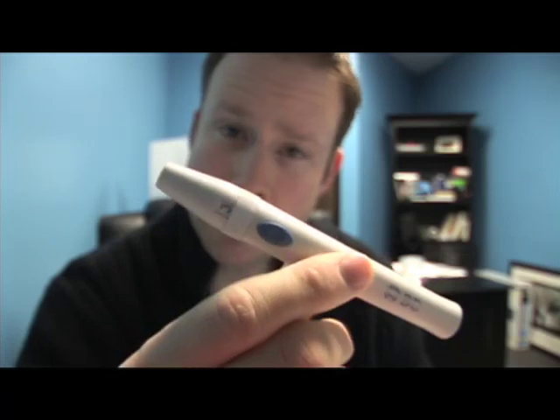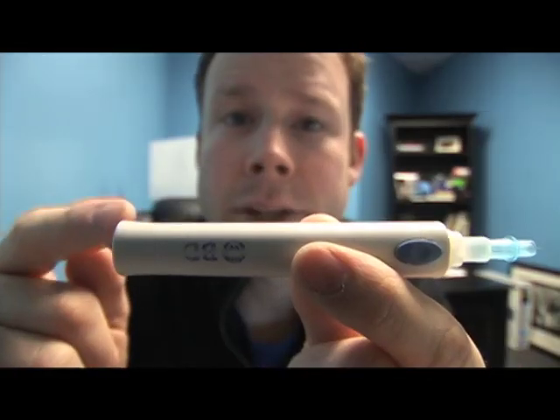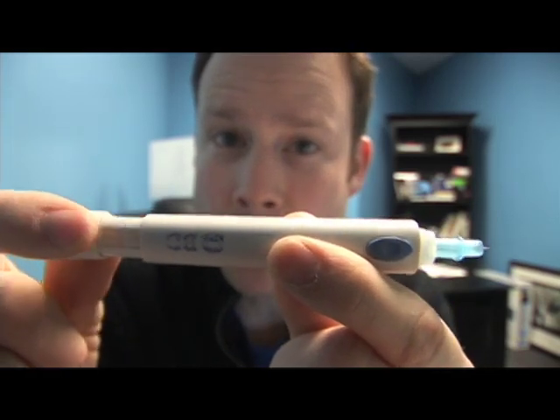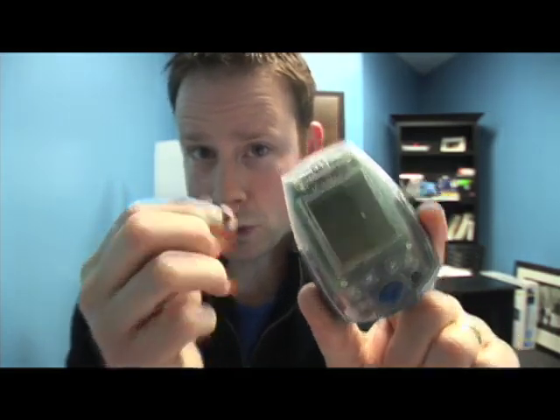Another thing inside my little satchel is this thing right here, which actually checks my blood sugar. Inside is this little pointy thing called the lancet. The lancet is what pricks my finger and causes me to bleed. This little end is like cocking a gun — you pull this back, it loads, and when you push that button, bring on the pain.